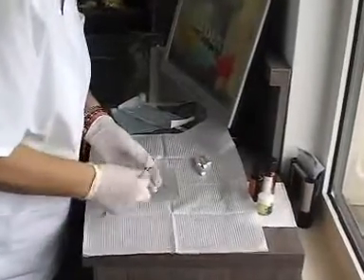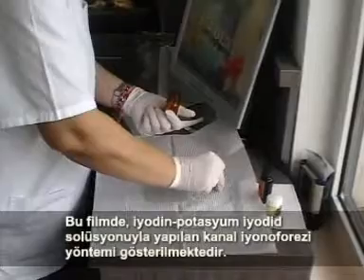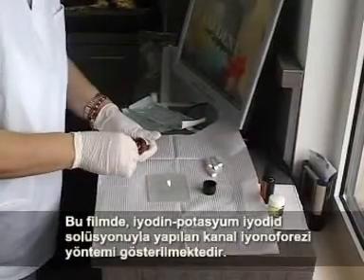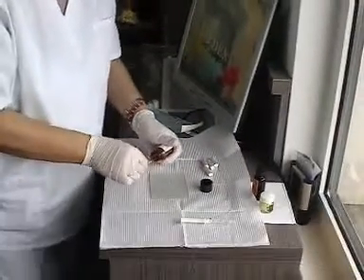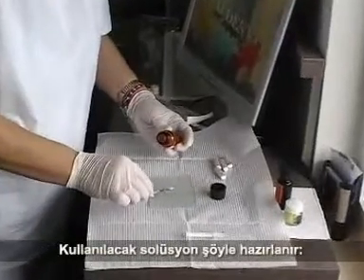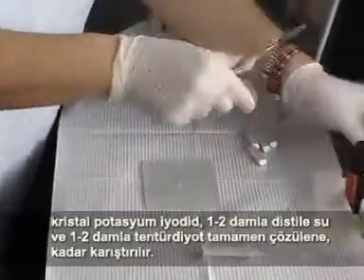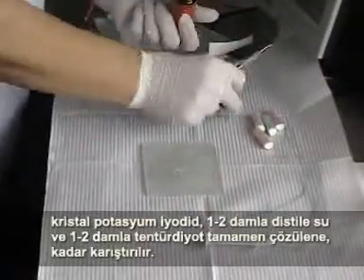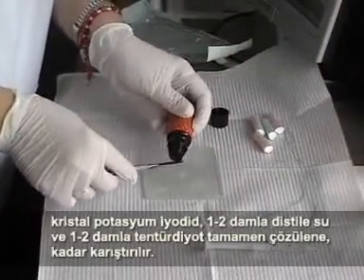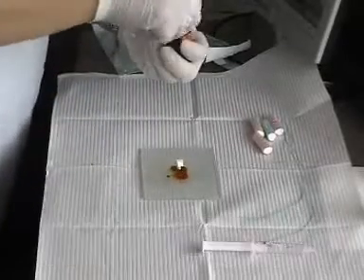The movie shows a frequently used method of canal ionophoresis with iodine potassium iodide solution. The solution is prepared when crystal potassium iodide is dissolved in 1 or 2 drops of distilled water and 1 or 2 drops of tincture of iodine are added until solution saturation.